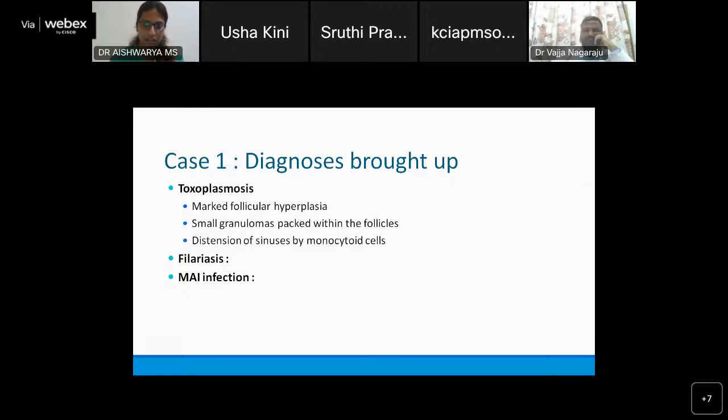Yeah, and moreover, I think your ZN would be really helpful. Let us see what happened to this case. We are still in the differential. We do not know what happened to the case. So in addition to MAI, you will find lots of myofibroblasts, lots of spindle cells, and you will find that it is loaded with acid-fast bacilli, and the patient is most likely to be HIV positive.